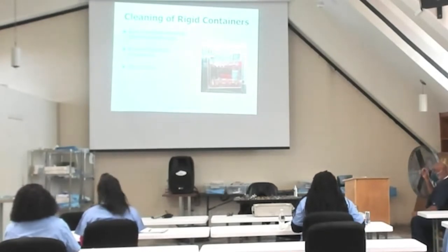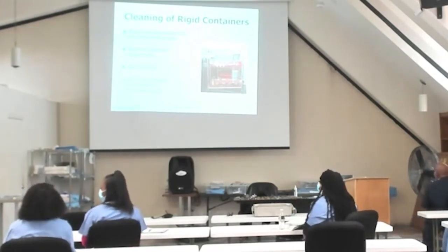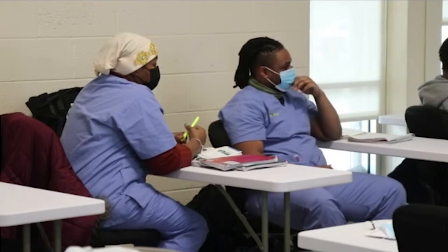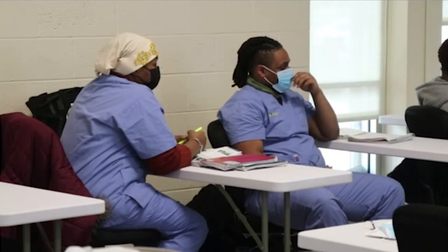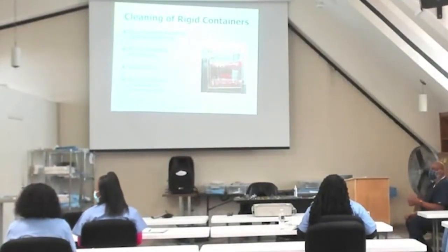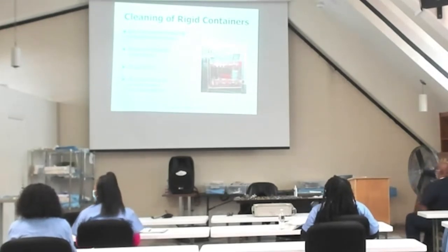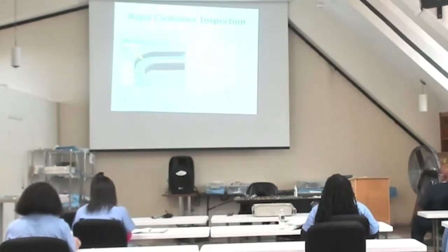Basins, good. Now, what else are y'all doing in decontam? Manual cleaning instruments, excellent, Terrell. Is there another method that you're using to clean my instruments? Mechanical? Great. How? What are you using to do it mechanically? Ultrasonic cleaner? Good. What else? Cart washer, two down, one to go. The washer disinfector? Good. All right. So you're pushing three things through.